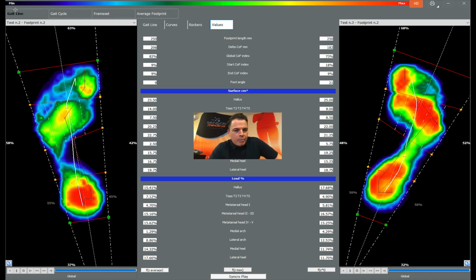Now, we're really big here on biomechanical chains, meaning that old song about your foot bone being connected to your knee bone, all of that. That's all true. It's all very much applicable, especially when it comes to these biomechanical joint issues. In this particular case, this was a back pain case. So why would we do a gait analysis on a back pain? Well, this individual had a knee replacement about a year ago. And when we did the gait analysis, what we found was the picture that you see on your screen.